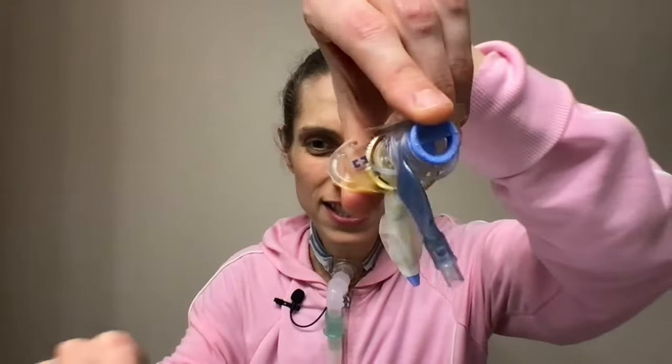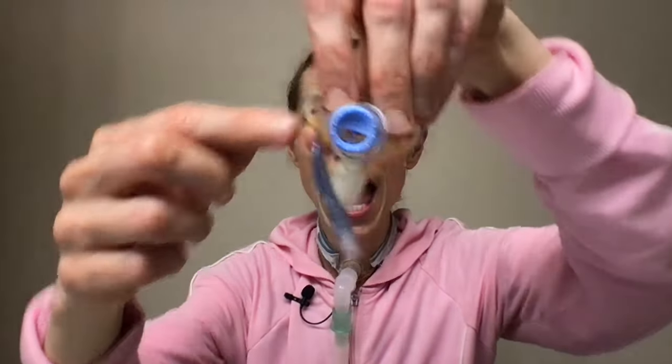The other cool thing about this is it has a hole. Do you see that hole? Let me show you. Look inside, and don't drop it. If you look inside, you can breathe through that. That is really important because when you insert this, you would not be able to breathe if there was no hole, but there is a hole so you can breathe. But don't rely on that totally because it is still partially obstructed and still very hard to breathe through.